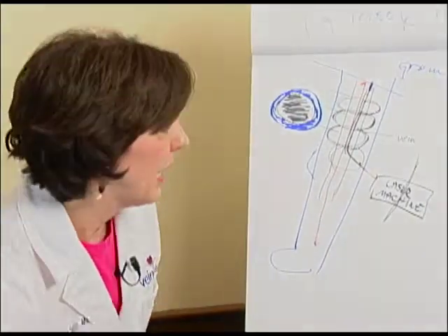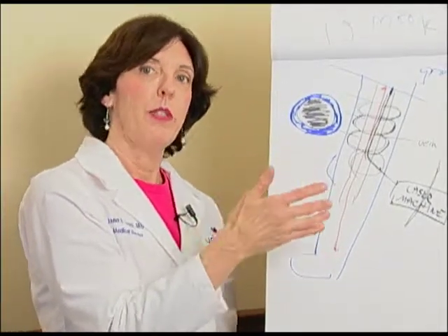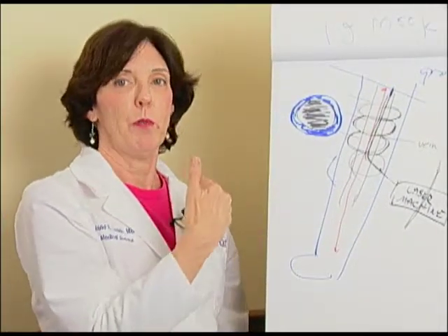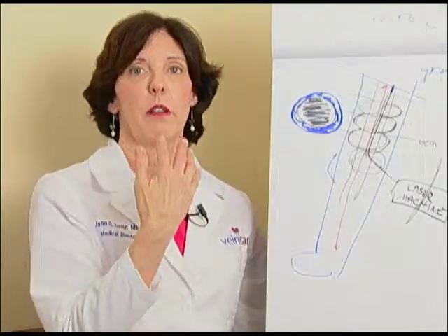Now, we have finished the procedure, again, 15 to 20 minutes. Then you're walked into the room, and then we will review with you the instructions afterwards.